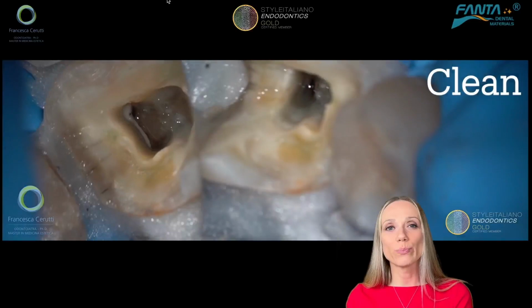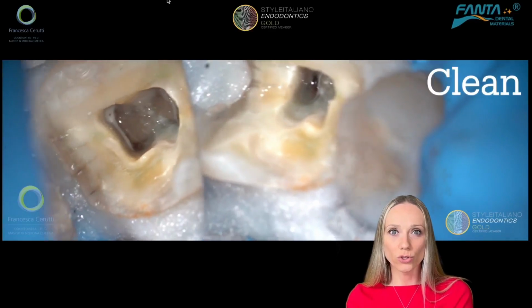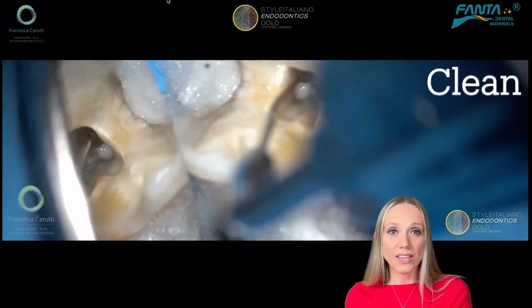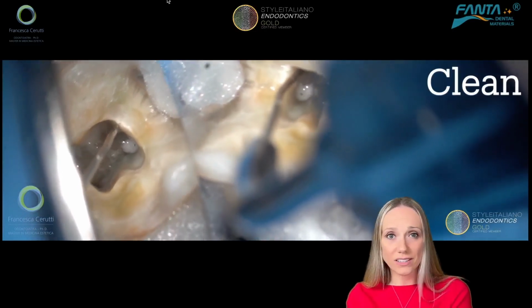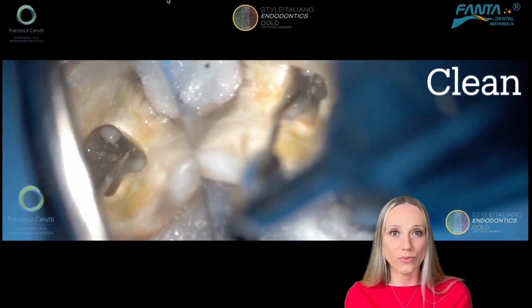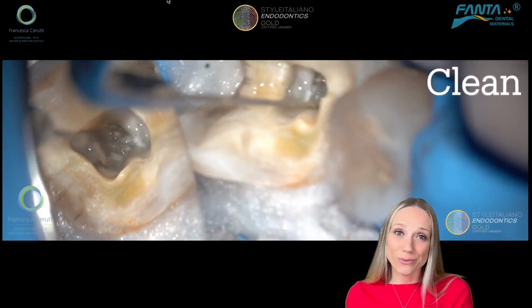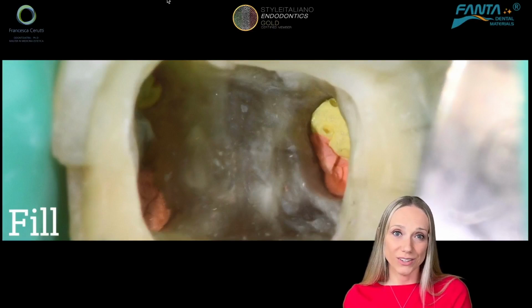And so we have to be as dedicated and as precise as possible to the phase of cleaning, because this is the moment in which we get rid of the microorganisms that could be able to cause an endodontic infection, apical periodontitis, etc. And so they could play a role in failure of our root canal therapy, even if our shaping was perfect. But it's not enough, because we have to fill adequately the root canal system.